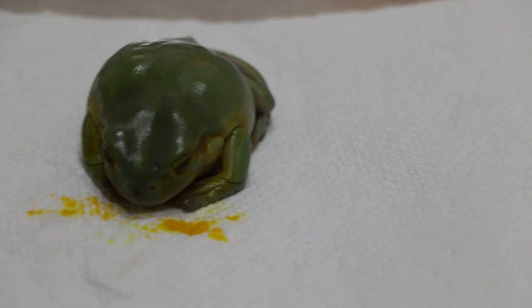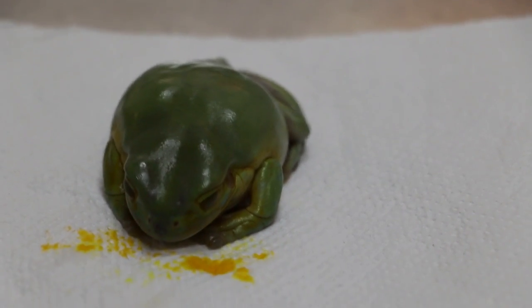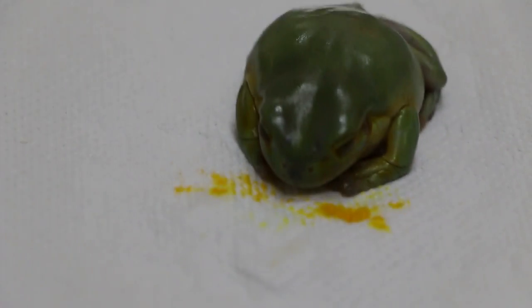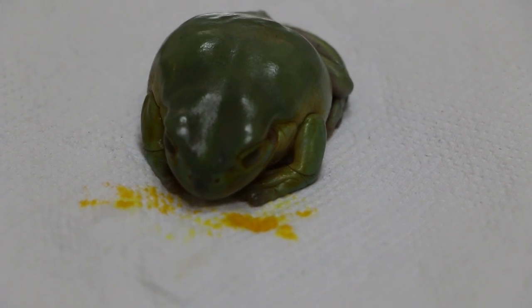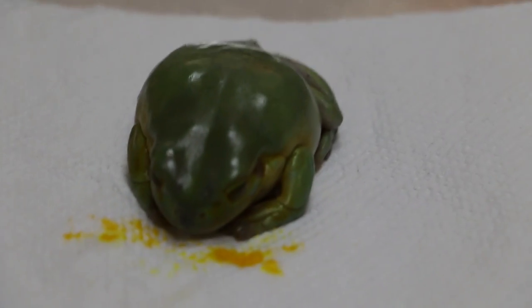This is not a dog, this is a frog. Just wait a while. Just touch a bit — no need to drop. Still got anything green? Shine the light — touch light. There. Switch off the light.